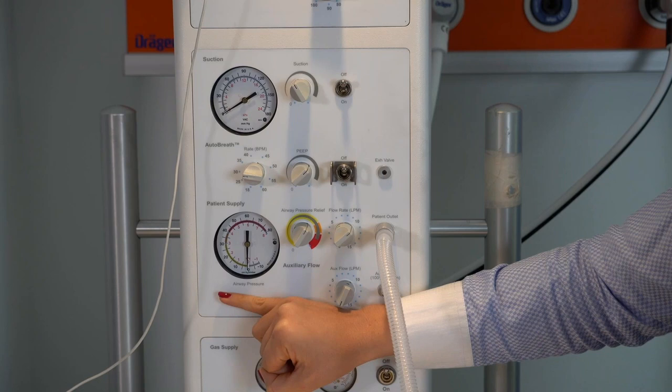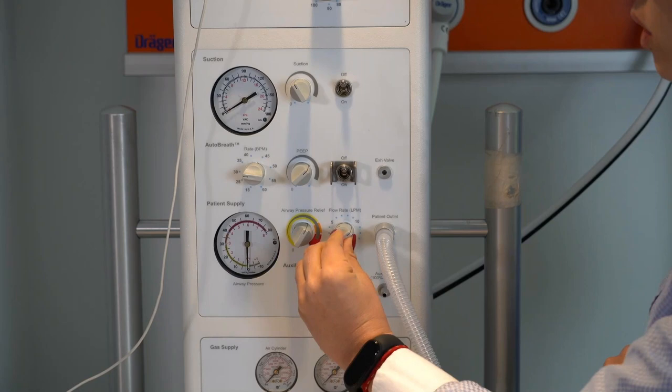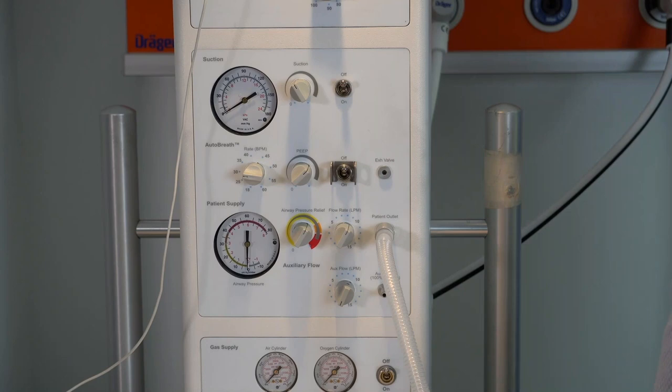And you can adjust the airway pressure by using the knob, by turning it up and down. And the same goes for the flow rate. You can adjust by using the knob, turning up and down. Also, we have the information about the gas supply. So this is either connected to the wall supply, how we have it here, or if you have cylinders, you can also connect it to the cylinders. I am going to leave out this part, the ambu bag part, on purpose, but I'm going to come back to it. So let's start by turning on the device.